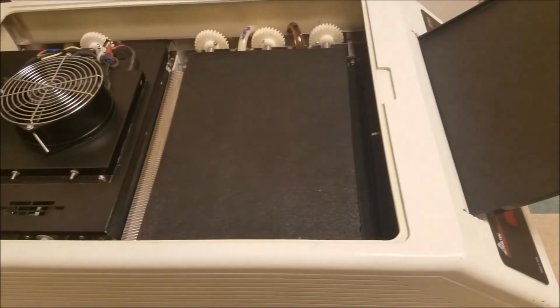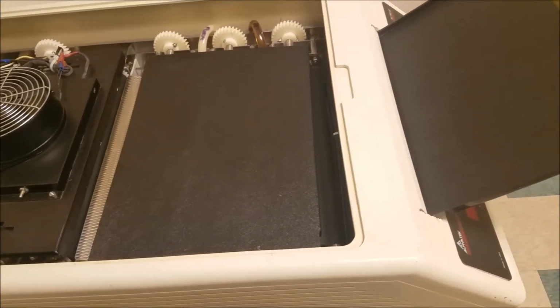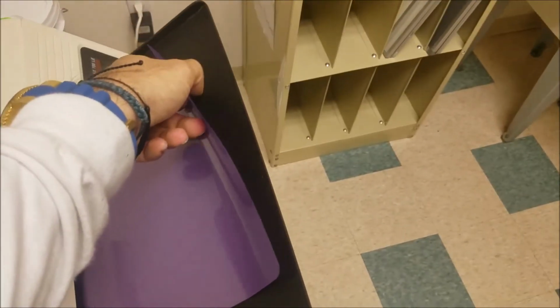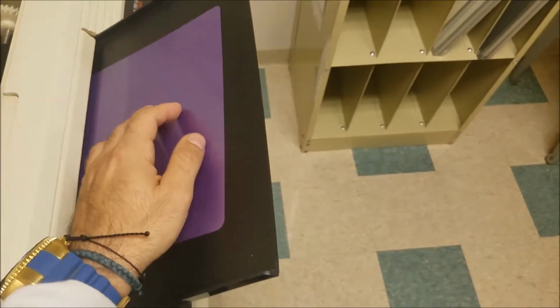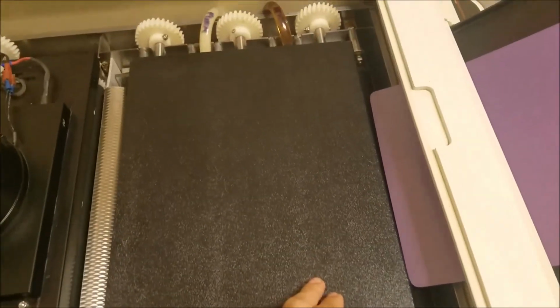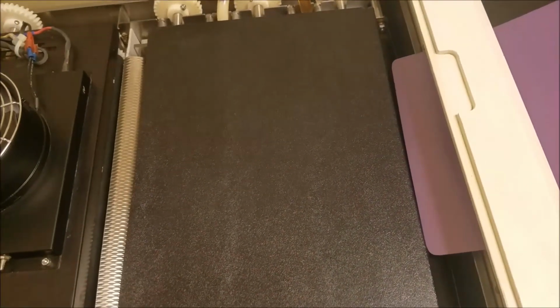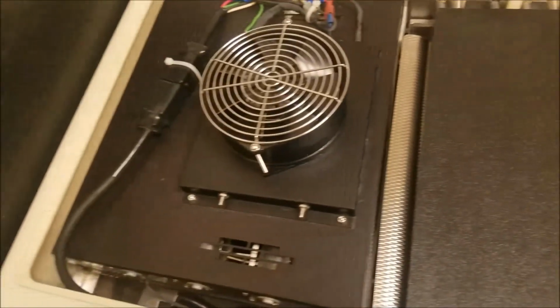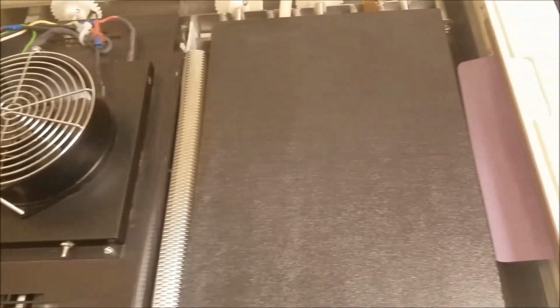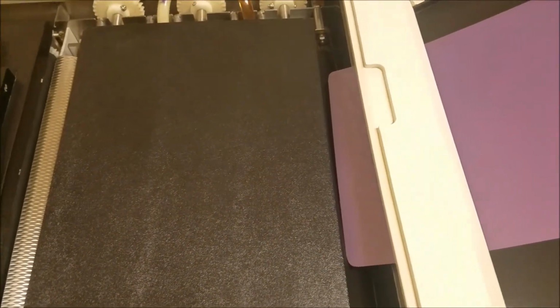This is the film processor, where we would place our film into the feed slot here. Then our film would travel down into the system using different types of liquid chemicals and other components to develop an image on the other side. This whole process is how we obtain a radiographic image on film.